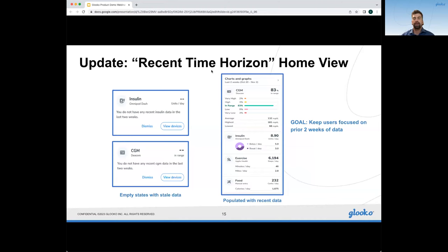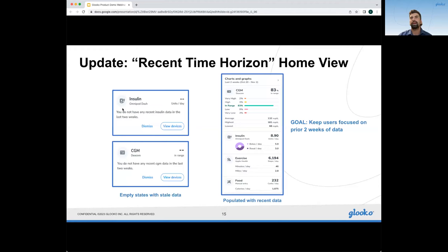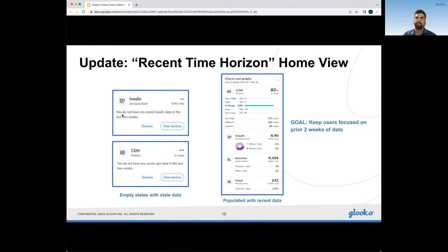Another update is a recent time horizon view on the home screen. In the legacy app, data always looked current no matter how much time had passed because the time frame was never shifting. On the new version, we're always looking at the home screen for at least the current two weeks back — always today to the previous two weeks. If two weeks pass and the user hasn't added data, they'll have an empty state that prompts them to do the next thing to get data back into that category. This lets users know their data has gone stale and it's time to refresh.